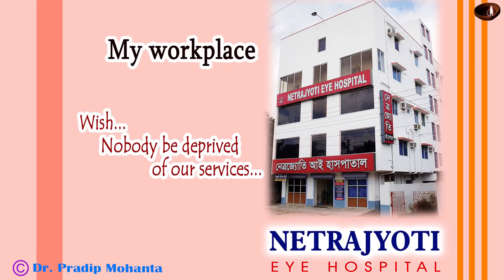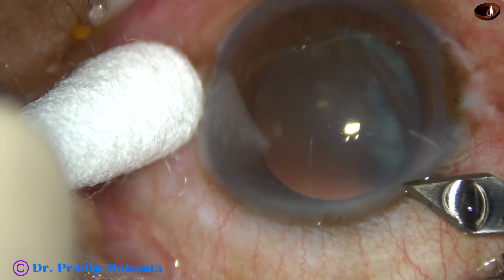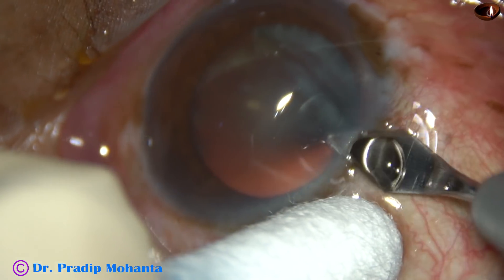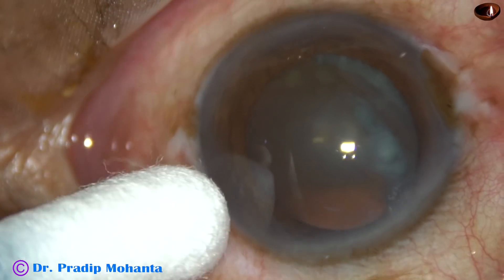Friends, welcome to my workplace at Ranaghat, West Bengal, India. This is a totally unedited recording of phacoemulsification of a soft cataract. Let us observe the surgical steps.